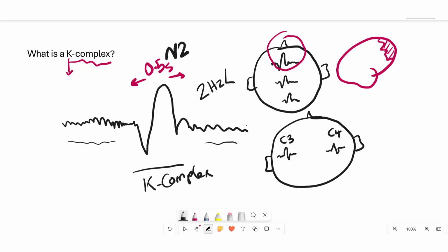Now let me add something to our wave here. Let me just plot another wave.